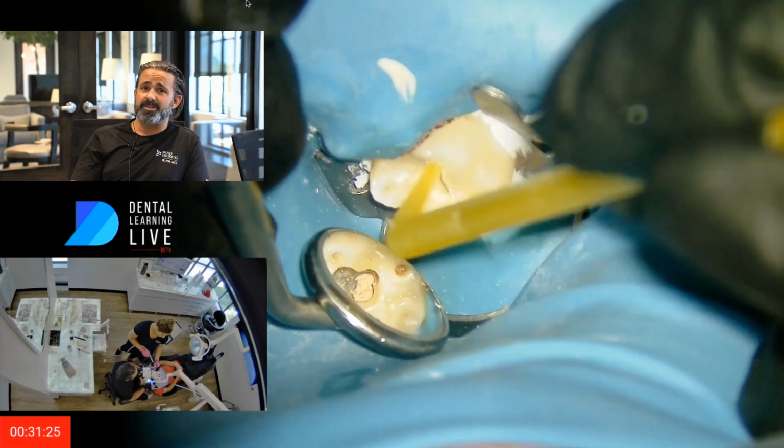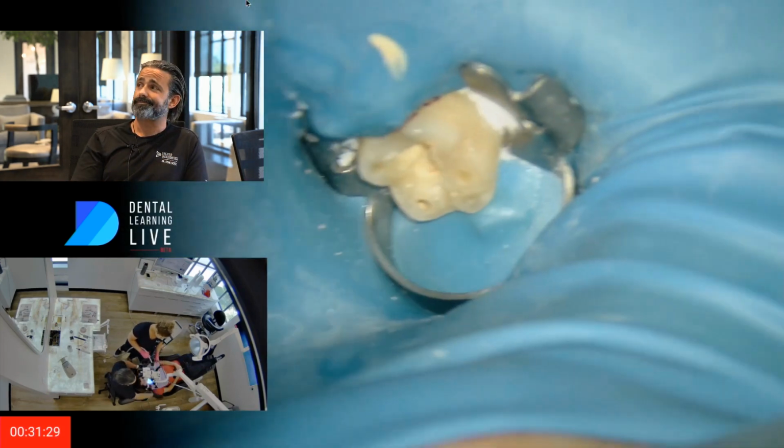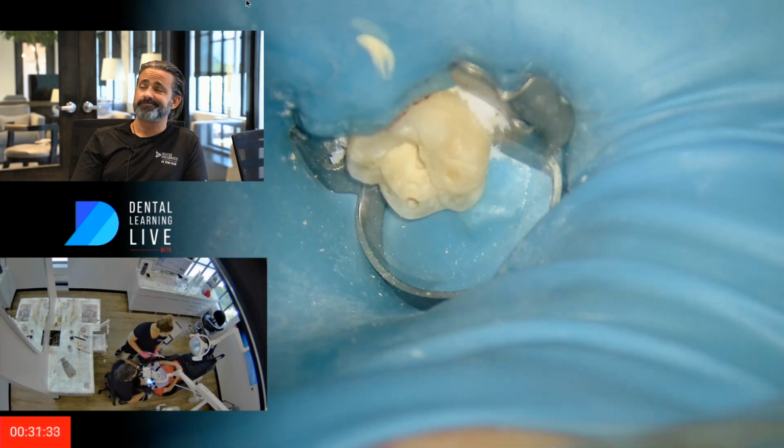And then I'm just going to clean up the sealer, the remnant sealer. I'll just clean it up off the floor. 31 minutes.